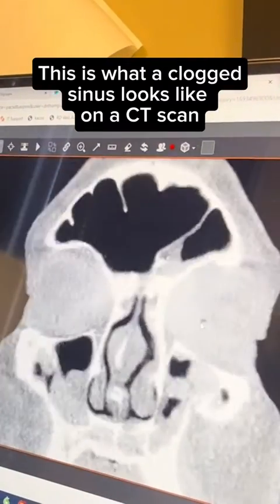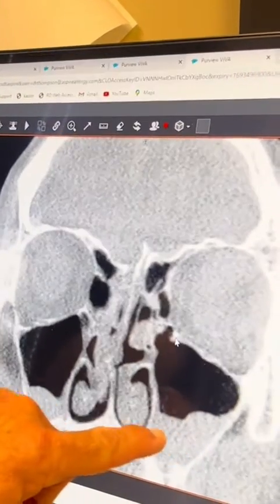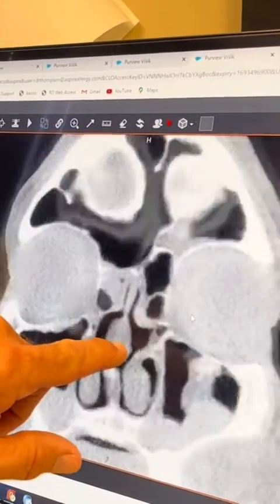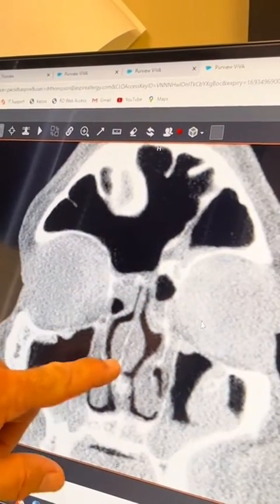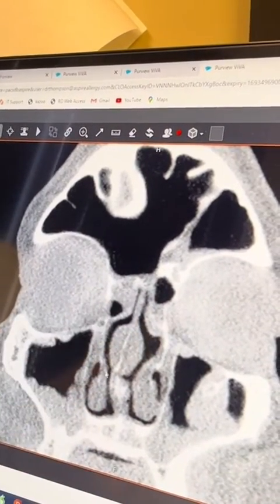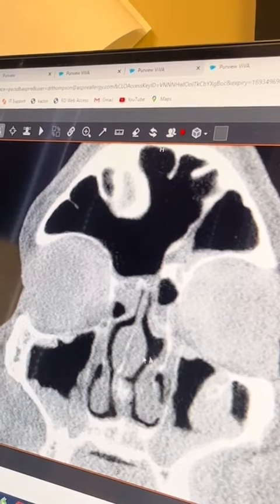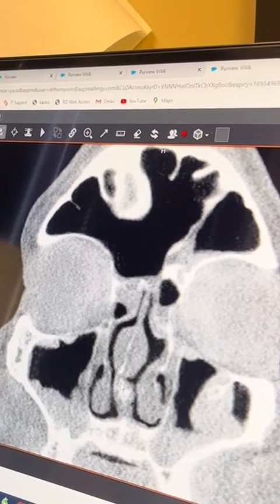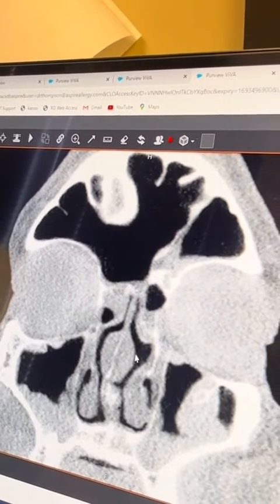The drainage pathways are a little bit narrowed, but overall his looks pretty good. If we compare that to somebody like this, you can see — wow, that doesn't look the same. This person has a bent septum which is really narrowing their nose and nasal cavity, so they don't breathe well.